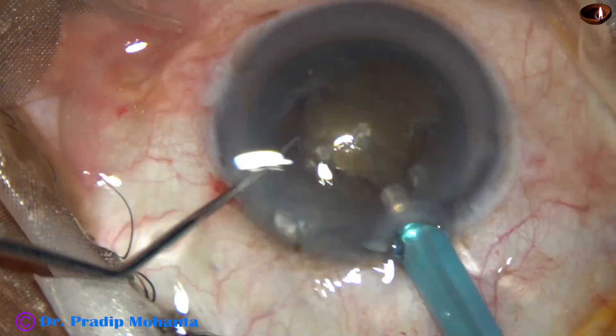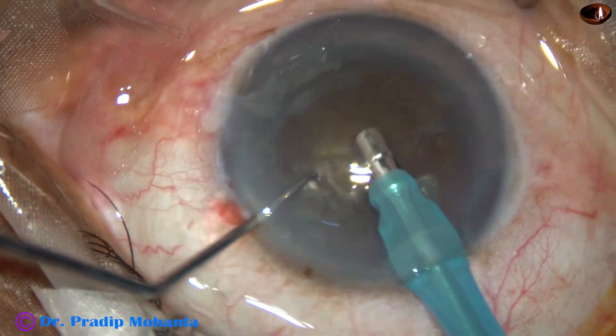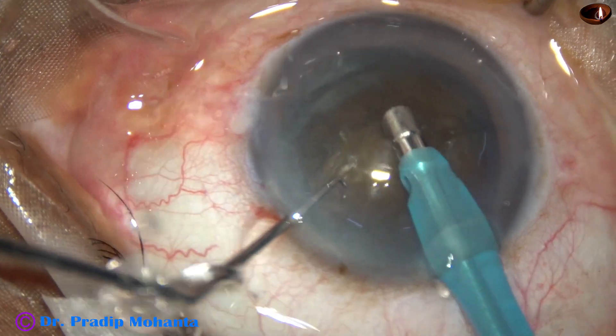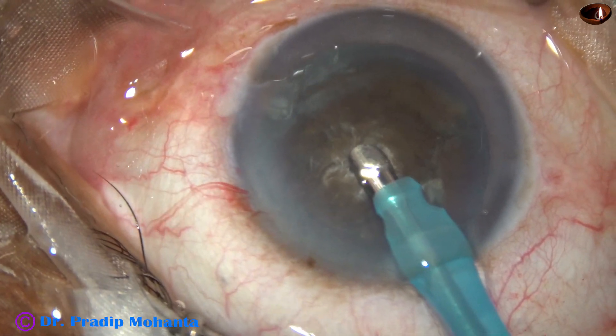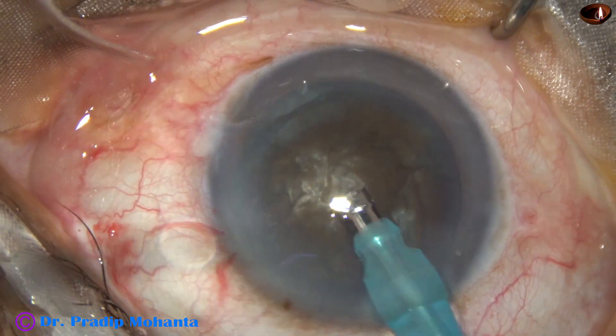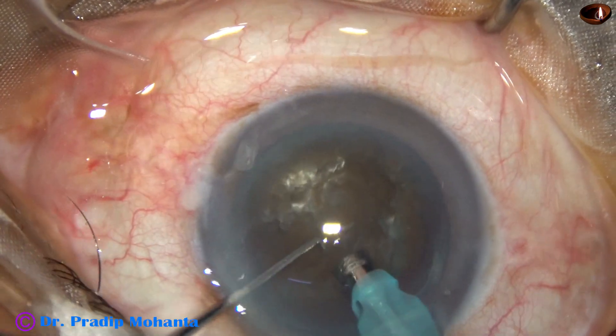Now the phaco needle goes in. See the exposed part of the needle — it is more than in usual cases. After aspirating some superficial cortex, the handpiece turns to make the bevel up. Now watch submarine chop.